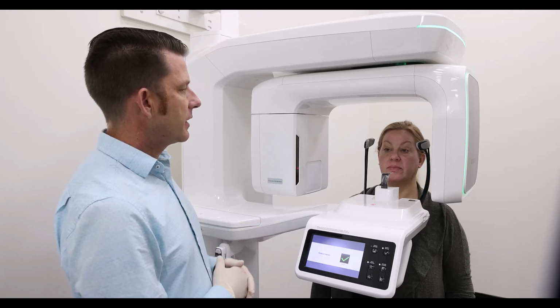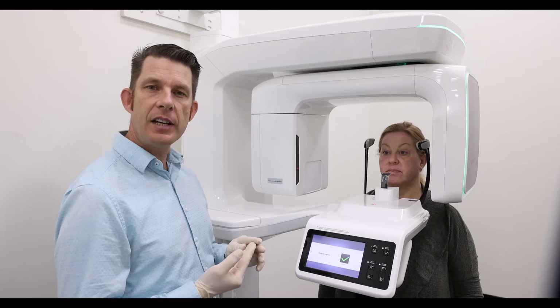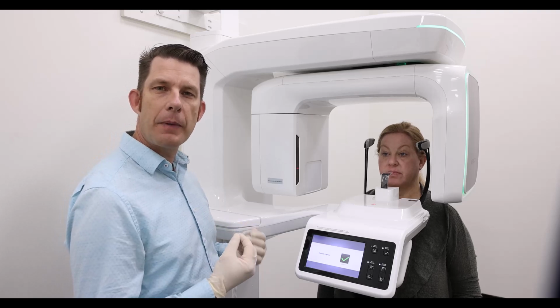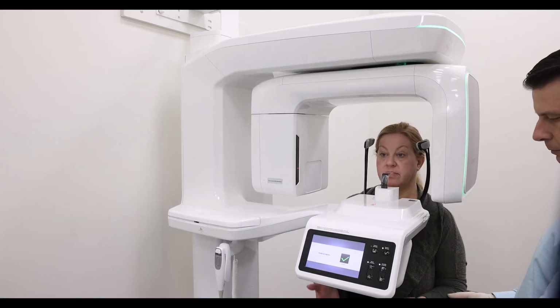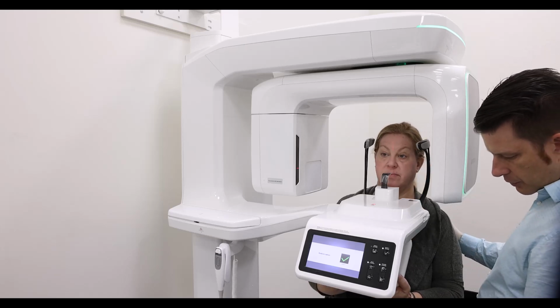Go ahead and stand up straight and tall for me. And we're going to start with our hands, our feet, and then have the patient bite on the bite stick. So go ahead and hold with your palms facing up. Walk forward and have your feet shoulder length apart.